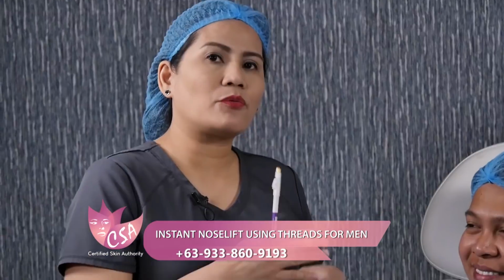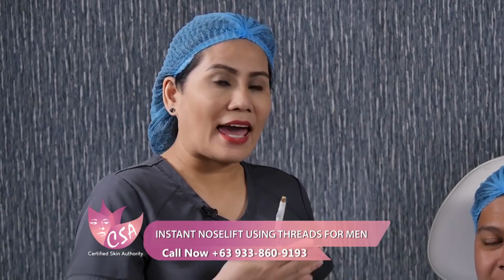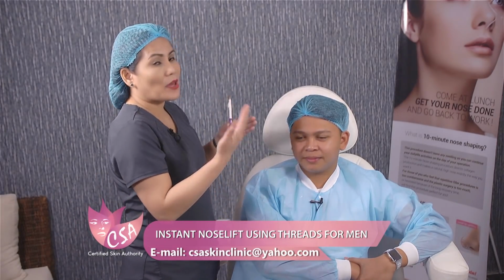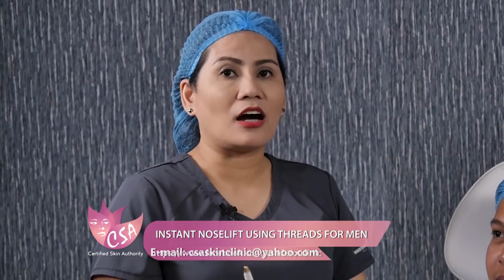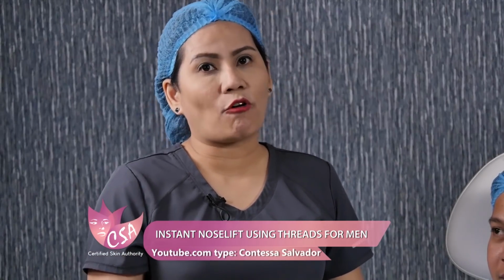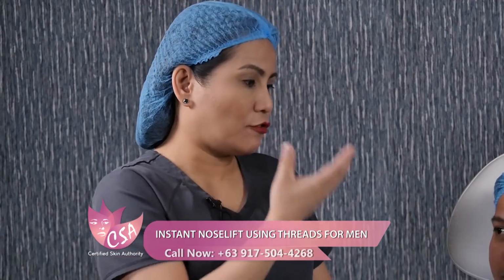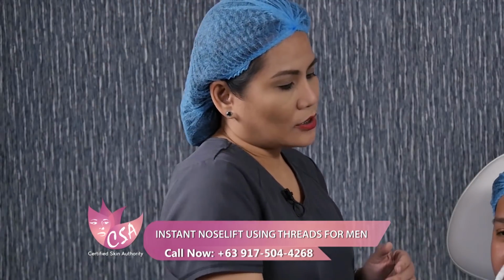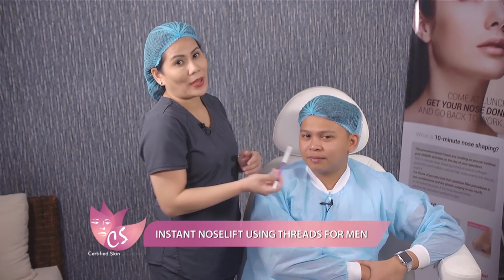So, sa CSA, whenever we do a treatment, importante sa amin yung analysis also. We again check for the nose anatomy. We have to analyze kasi 5 years na actually the nose injection that was inserted, nag-hydrolyze na po yung product. Okay? But we were mentioning before na after hydrolysis, somehow there's a development of some tissue fibers inside. Okay? So we did in the past injection into the nose bridge and also tip and into the columella.